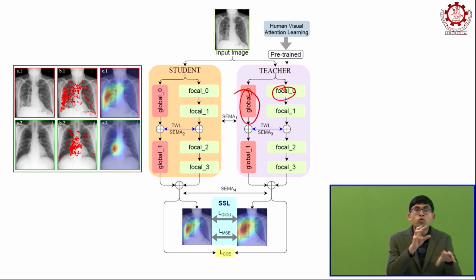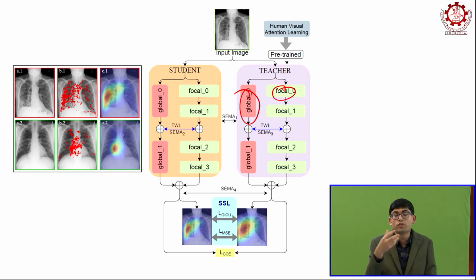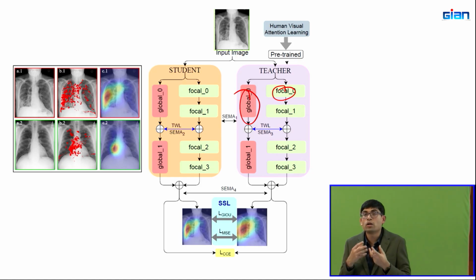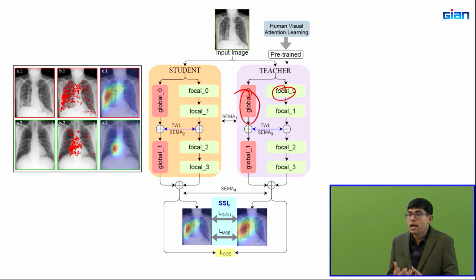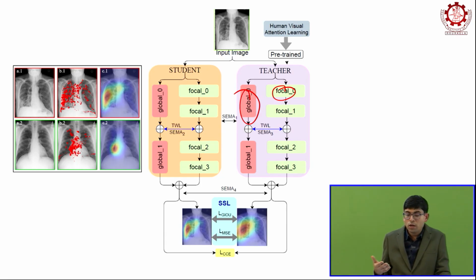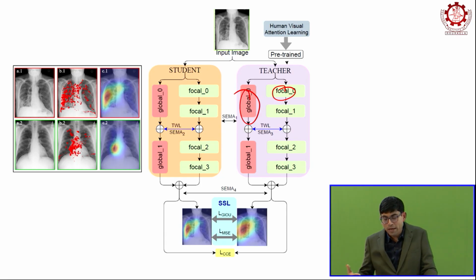Then they start zooming into the areas which they think would be interesting, and start dissecting what's in there, making some sort of observation and making decisions based on that. So there's a global pattern and there's a focal pattern, or a global and a local pattern. And that global and local search strategy is something that we try to replicate using a transformer mechanism.